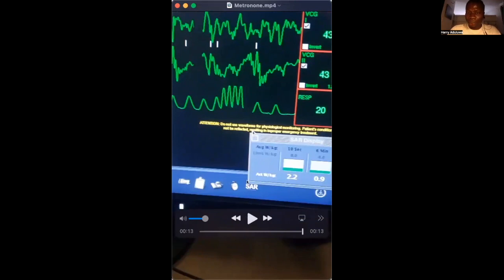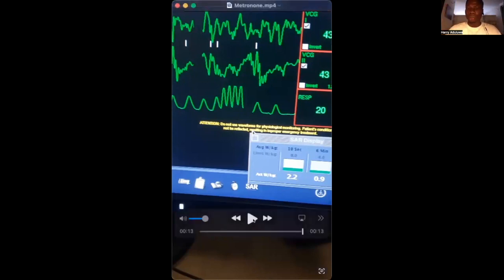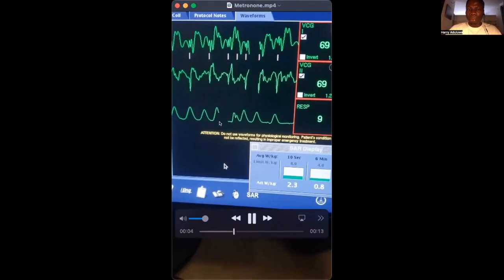Now, the idea is I have to do this video myself. When I play this, take note of this, because this is the ECG reading on the system. You can see that the patient is taking a deep breath in, a deep breath out. For 2 minutes, the patient will do this. That is what they call hyperventilation. So you are assessing the myocardium when the patient is loading him or herself with a lot of oxygen. You run the sequence, and then you send the same sequence to the radiologist, and the radiologist can run an analysis with analysis software. Let me play it again so that you see. Follow my breathing, breathe in, breathe out.